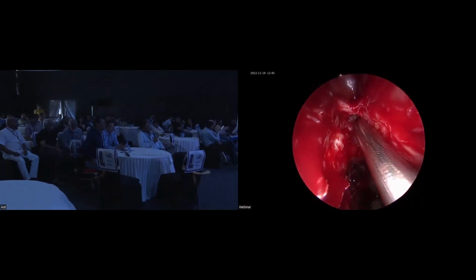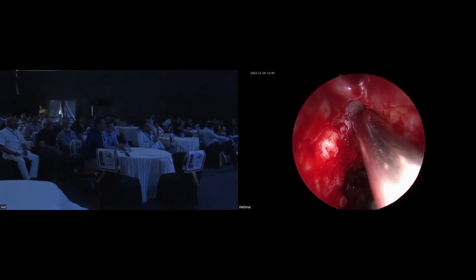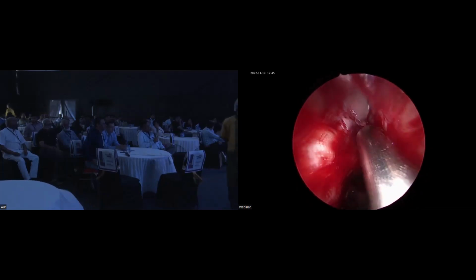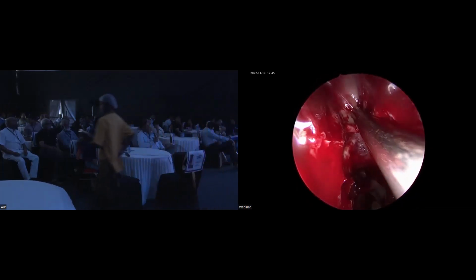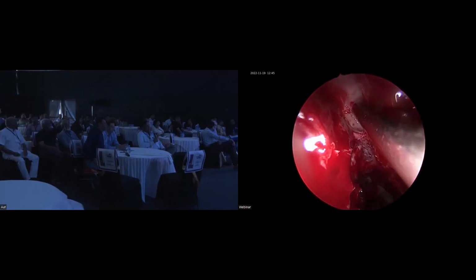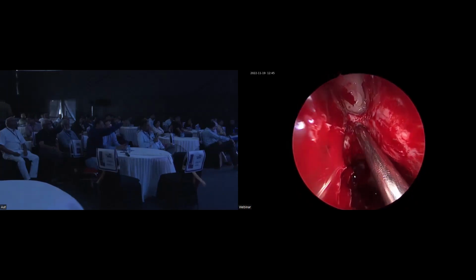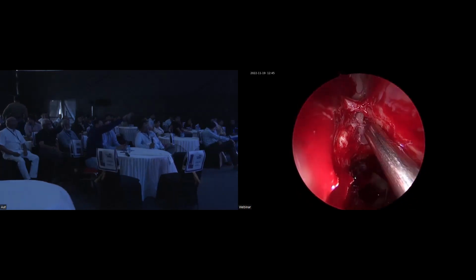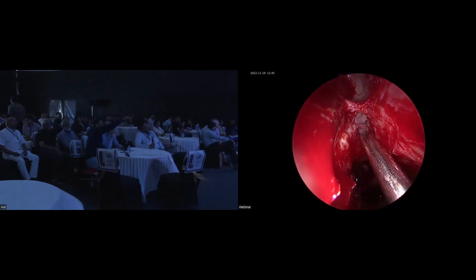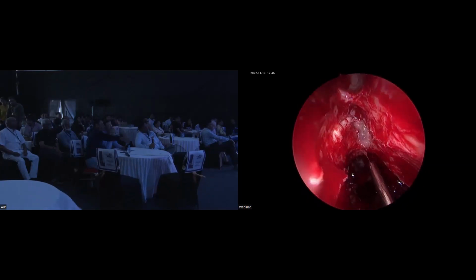To show you all the landmarks, this is the anterior ethmoidal artery. I have a little disease which is going behind, which I'll also try and clear. This is the polypoidal mucosa of the frontonasal recess. We don't want to create any raw area here. Sometimes you have more than one twig. Small upward, baby upward.